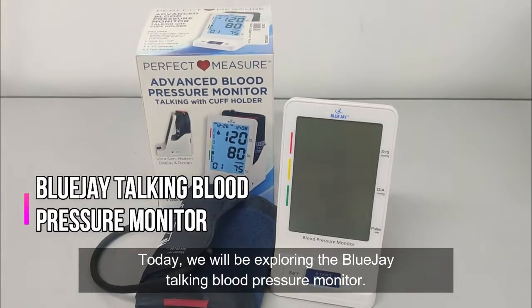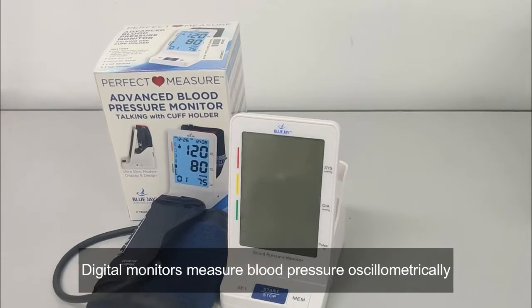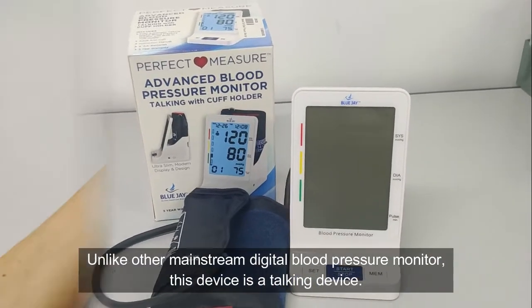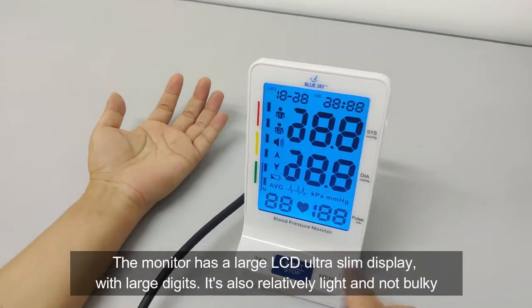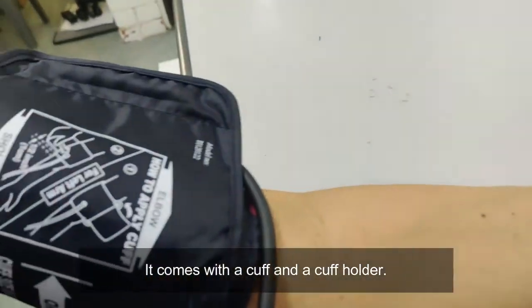Today, we will be exploring the BlueJay Talking Blood Pressure Monitor. Digital monitors measure blood pressure oscillometrically. Unlike other mainstream digital blood pressure monitors, this device is a talking device. The monitor has a large LCD ultra slim display with large digits. It is also relatively light and not bulky. It comes with a cuff and a cuff holder.